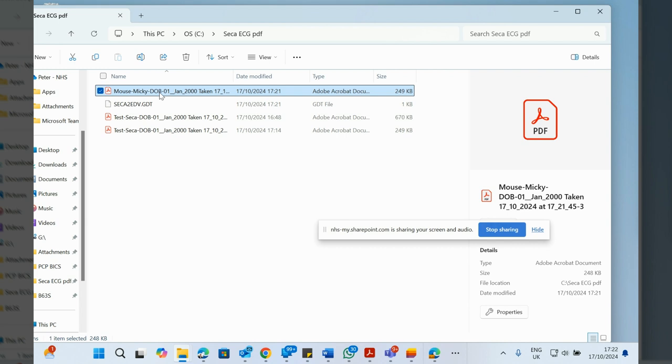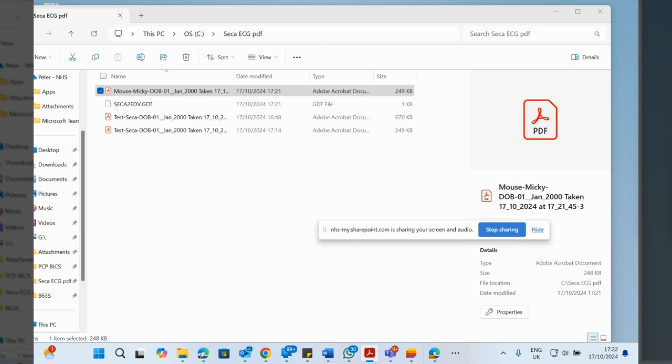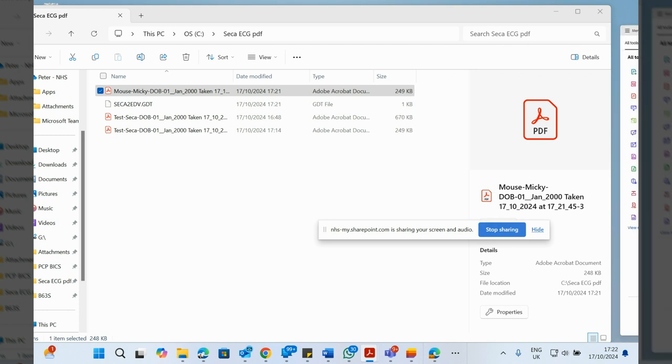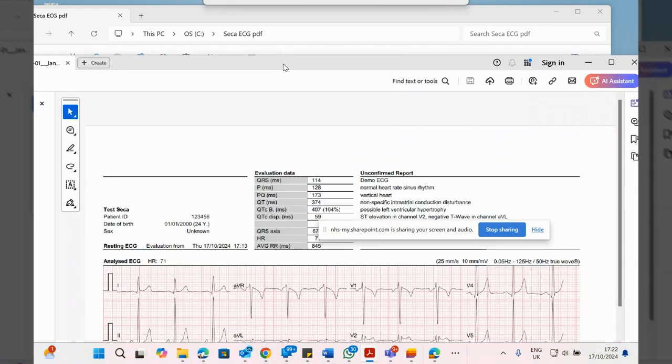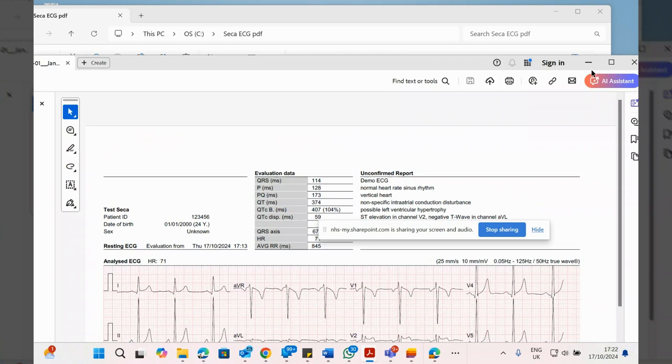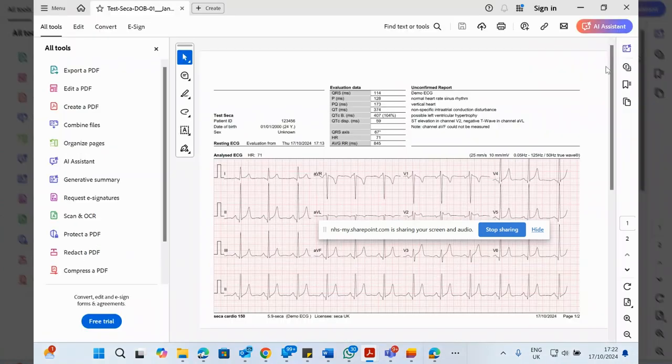That will open the PDF. I'm just going to drag that onto the screen I'm recording. There we go, got our demo ECG, automatic diagnostics in the top right. The ECG is all there and you can review that.